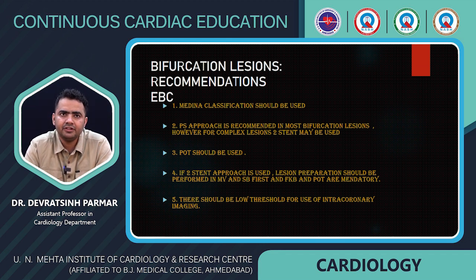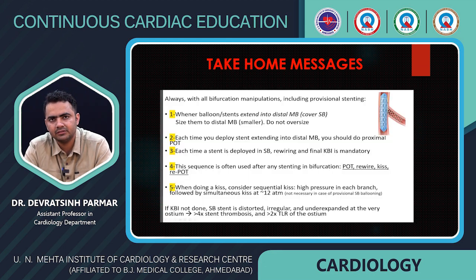So basically, bifurcation lesion recommendations. The commonest classification that we should use in bifurcation technique is the Medina classification. Provisional stenting approach is recommended in most bifurcation lesions. POT should be properly done. If you are going ahead with the two stent strategy, lesion preparation is very important, and there should be a low threshold for intracoronary imaging techniques.